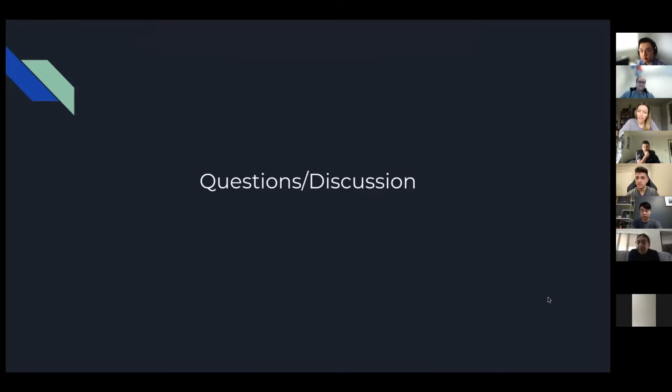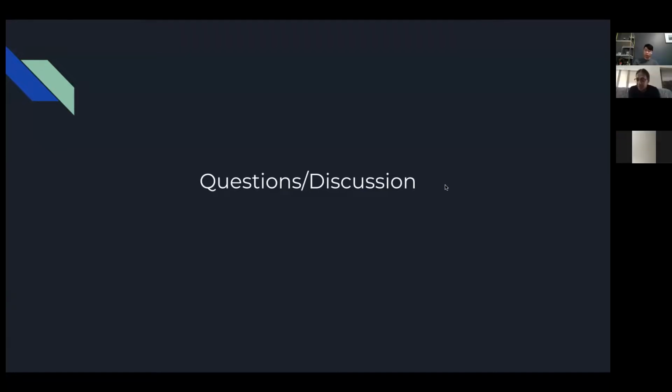Hi. Great talk, really great talk, and nice to see everybody so much into POCUS. And just a comment, yes, Melanie, what you said was very right, that the more parameters we measure, the more reproducibility, and if one resident does it, another resident can come and reproduce as a follow-up, because there are multiple parameters to study.